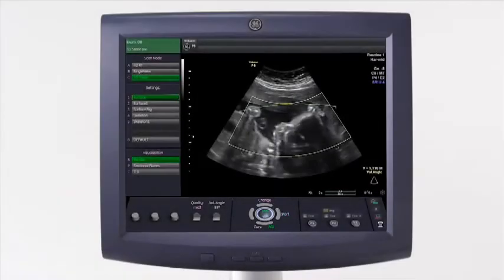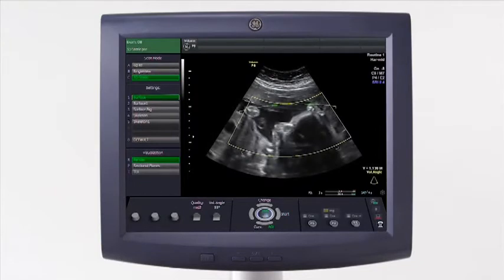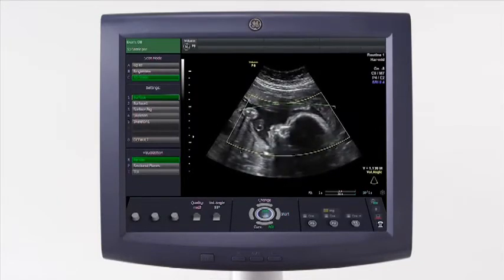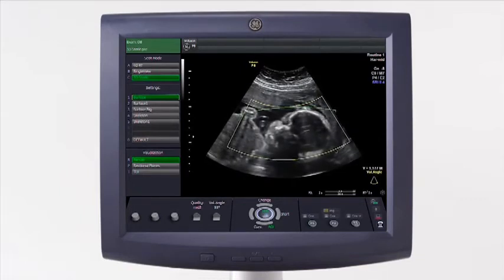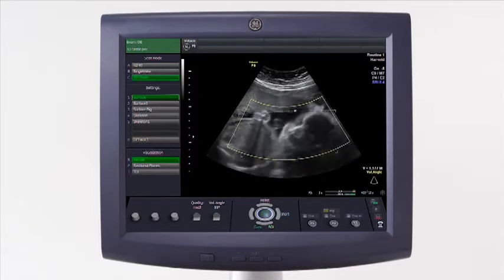The area within this region of interest is the information that will be included within your volume. The green line is the render line. Everything below the green line will be displayed in the rendered image. Use the trackball to move the ROI and place the green line within the fluid. The green line can also be curved to help avoid any areas you don't want to include in front of your rendered volume.